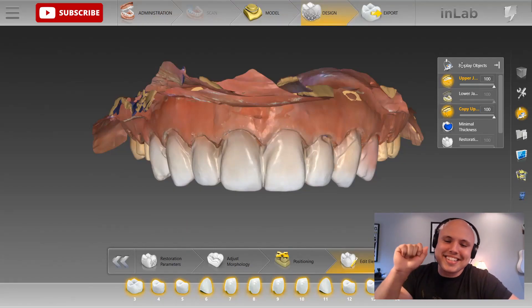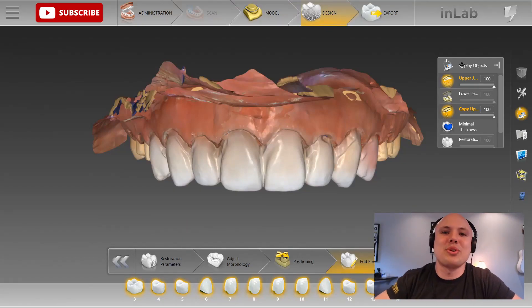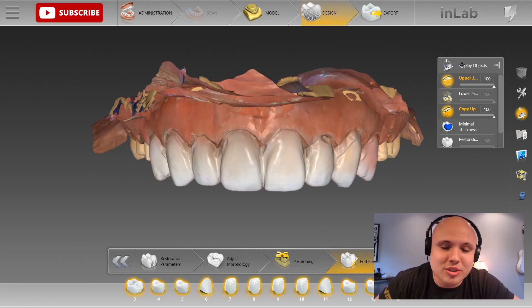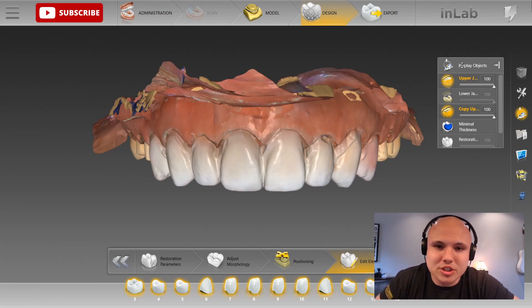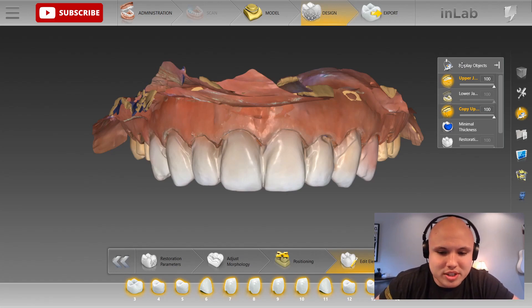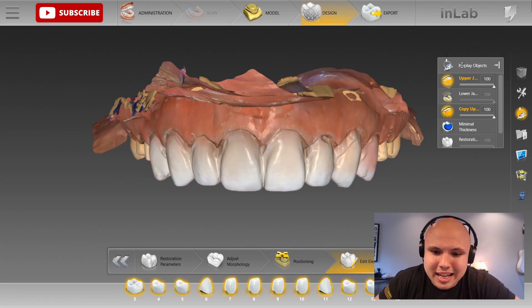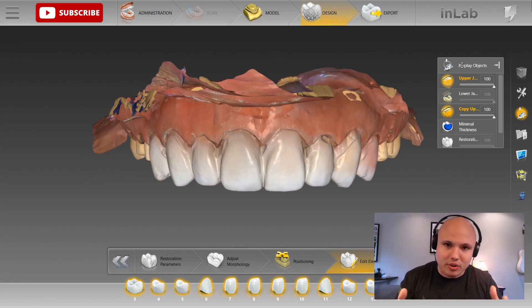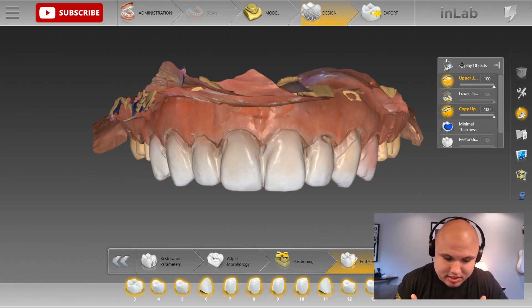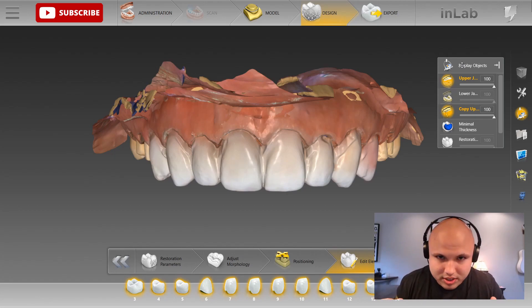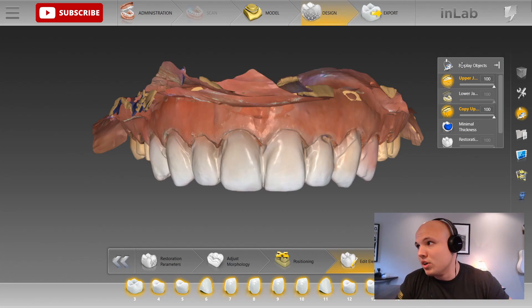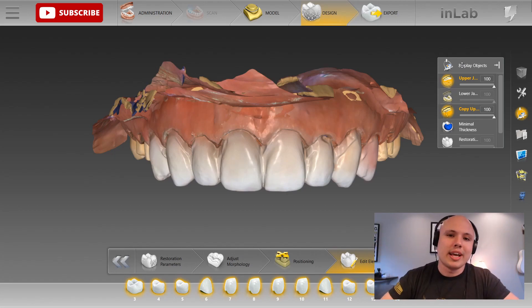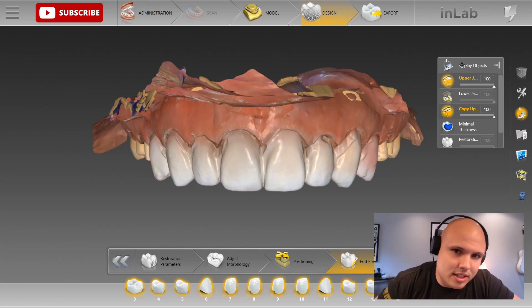All you cool cats and kittens. Today, I want to share with you a very valuable technique that you can use when you're doing your full arch restorations with CEREC. The key to any predictable outcome, whether it's a six-unit anterior case, four-unit anterior case, or full arch, is proper references.